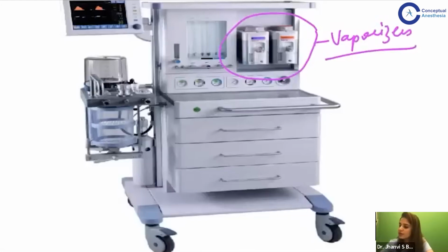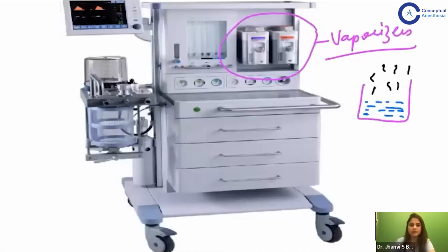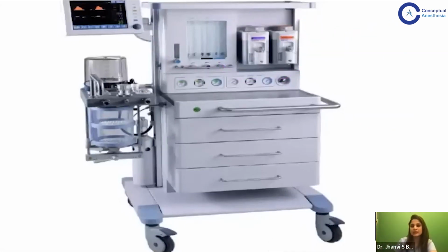Okay. What does a vaporizer do? Basically, the vaporizer will have liquid anesthetic agent in it, and it will convert this liquid anesthetic agent into vapors. Now you will say, ma'am, what is the question that will be asked in the exam? The question that will be asked in the exam is to identify what is the inhaled anesthetic agent in the vaporizer. We will discuss that ahead when we discuss inhalational agents.